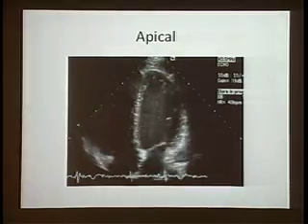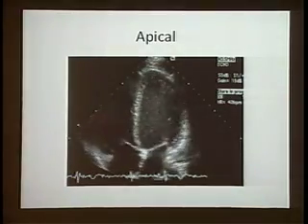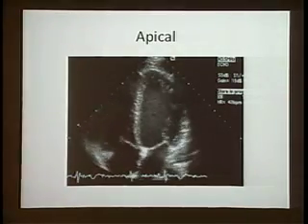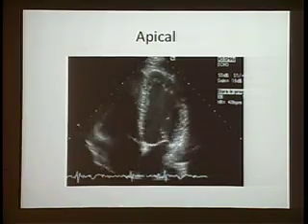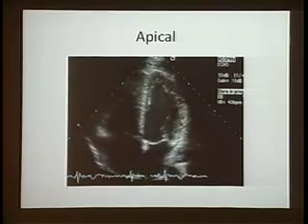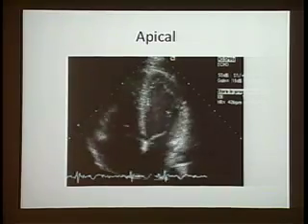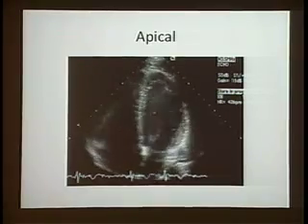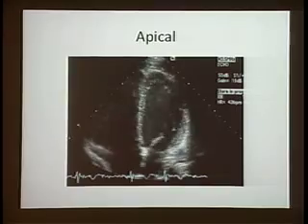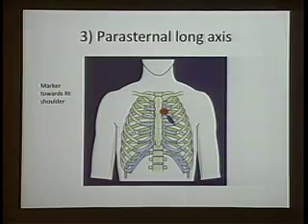And this is how it looks. And again, it's not a bad thing to have EKG attached to it. Some of the ultrasound machines that we do for this, for the surface echoes, don't usually get that. If you're getting an exam that is going to be recorded for the cardiology department or for the record of a patient, most commonly they have an EKG. It helps you a little bit when you're doing some Doppler measurements and things to know where you're on the cardiac cycle, and you use EKG for that.